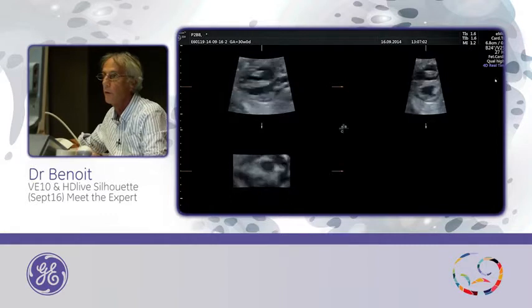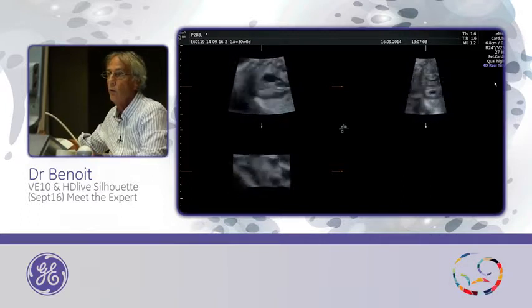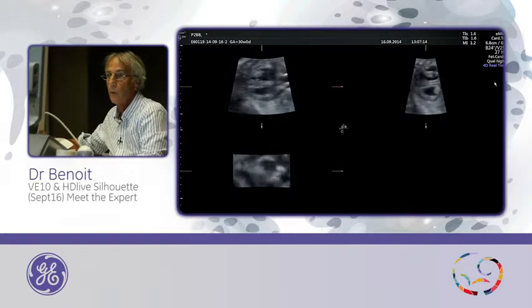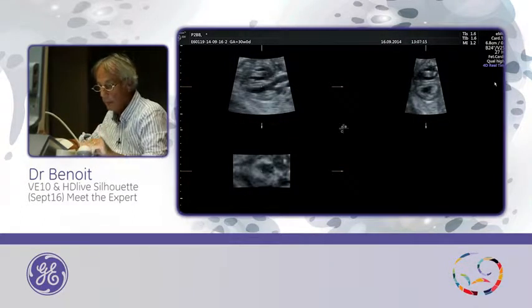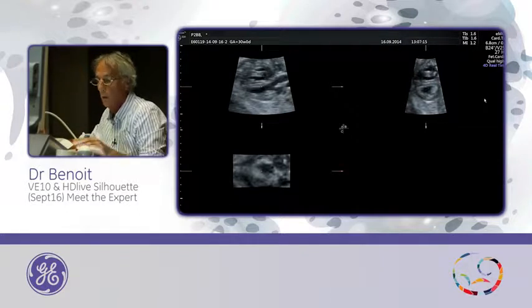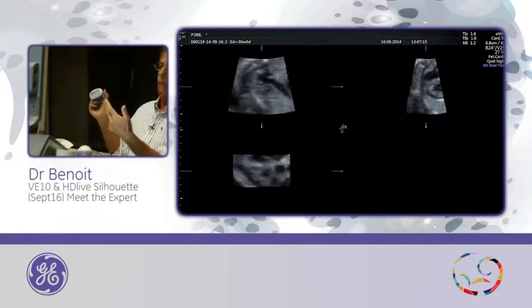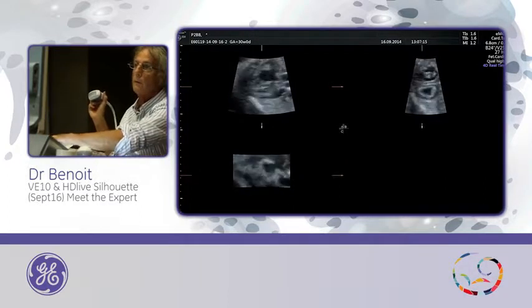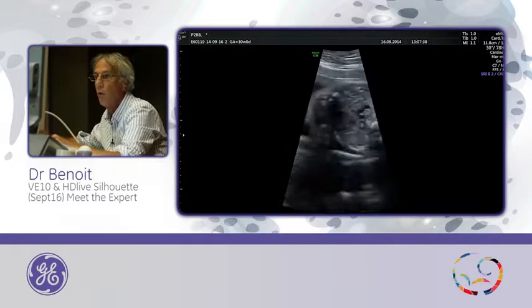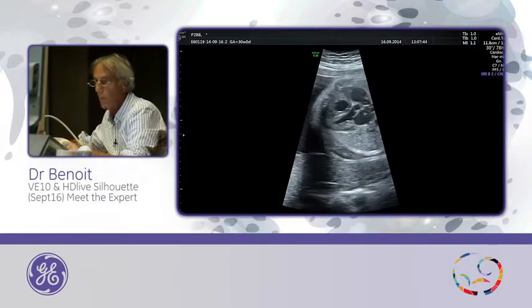This is real time, with a frame rate of 27 frames per second, meaning volumes per second. That means here you can do one examination like this. You can sweep, you can save it, and now you can play the loop. Start. And this is 4D of the heart, and now you can move on it. So you can do a STIC, but also you can do a 4D of the heart.